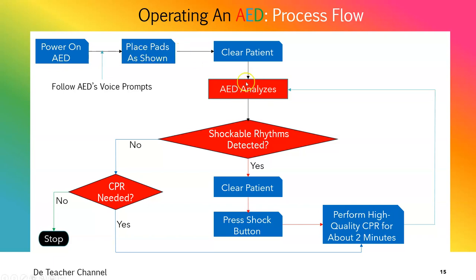So analyzing will start shortly after powering on, and at this point, you, the operator, should clear the patient. Make sure that nobody is touching the patient at that time.